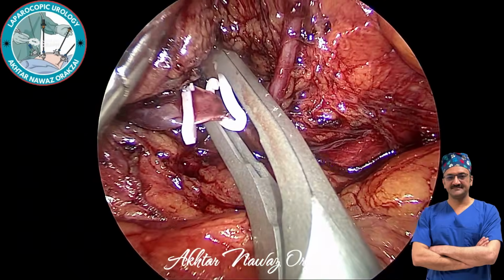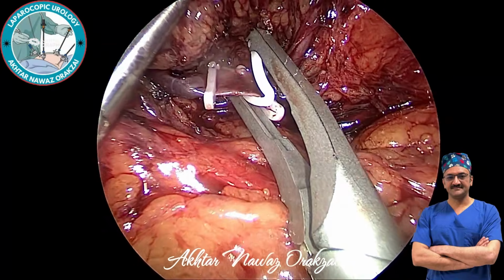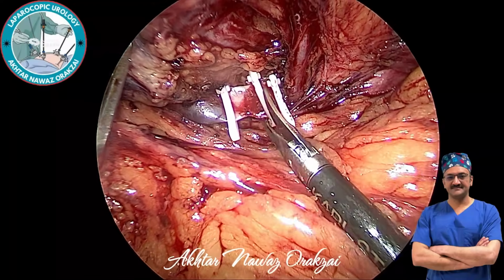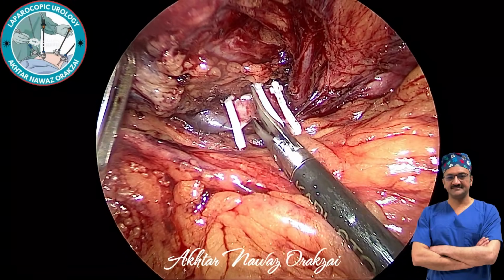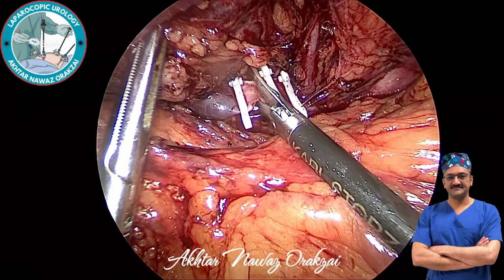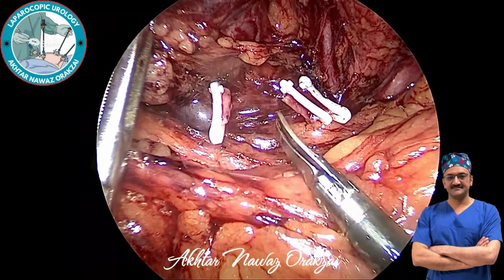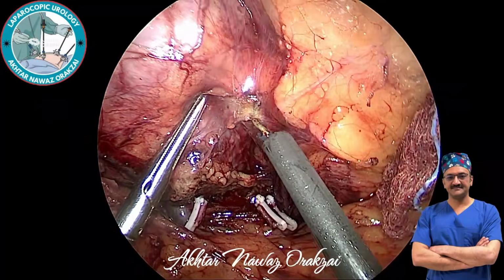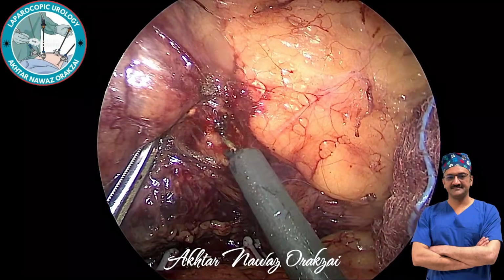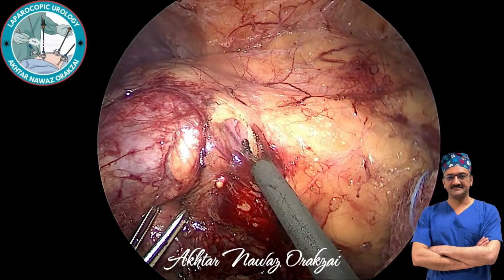So here you can see that vein has been separated, and as the adrenal vein is quite big, I have applied 2 clips on the proximal side. Some would say the distal side of the vein. However, the portion of the vein that is remaining, I have applied 2 clips. Now, dissection of the adrenal gland from the upper pole of the kidney.